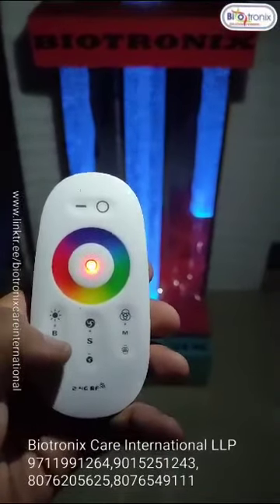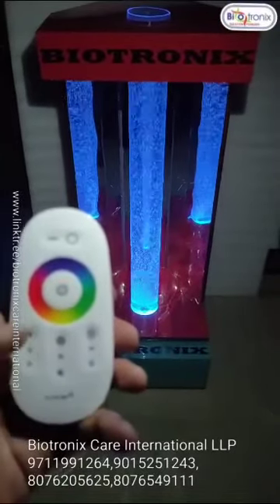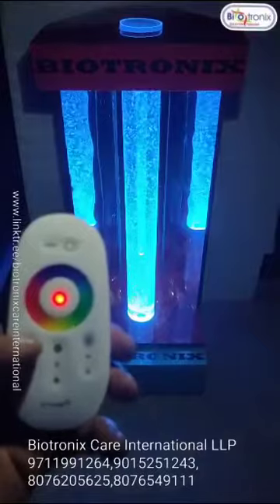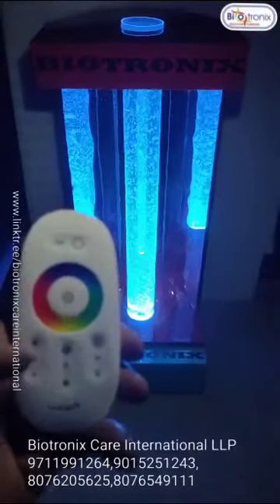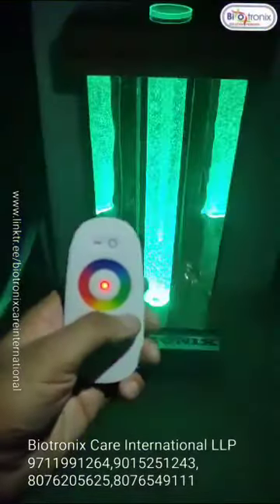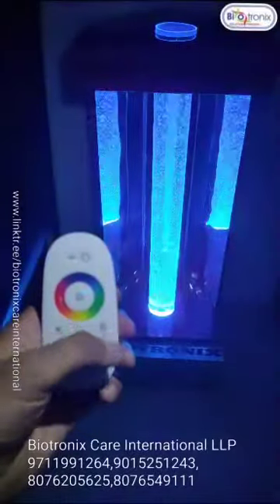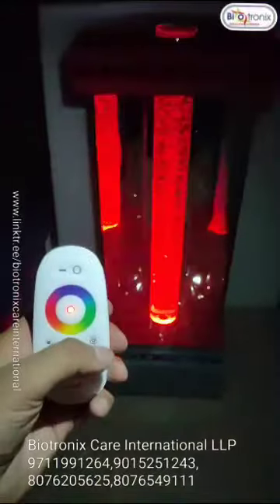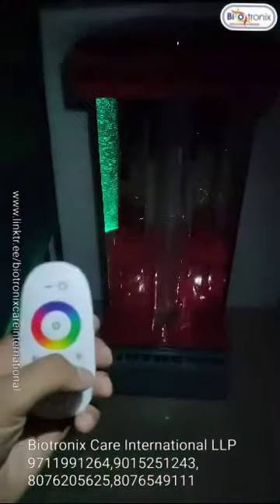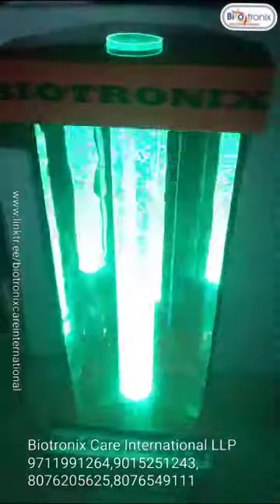You can adjust the brightness with this button. This is how it looks, how it feels, in three seconds.